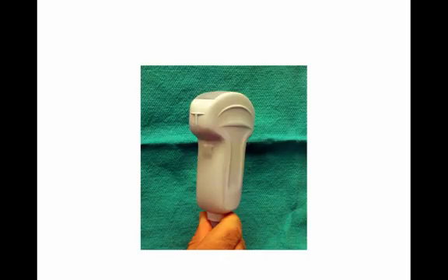The probe is oriented so that the marker shown here is on the right of the patient's body. This will become clearer as we show you examples of scanning technique. Well, how do we begin? In all our tutorials, a recurring theme will be the approach to the basic application. What do we mean by that?